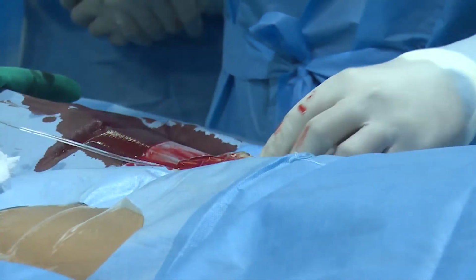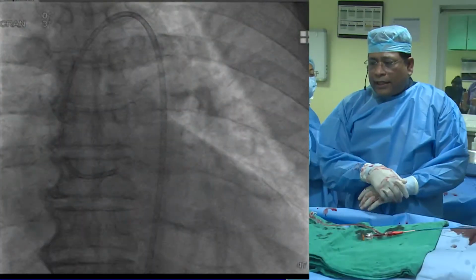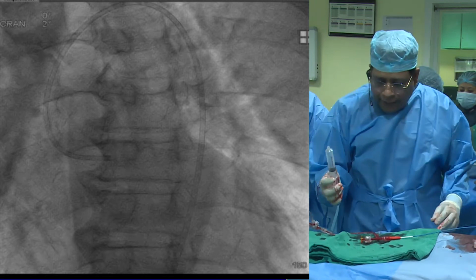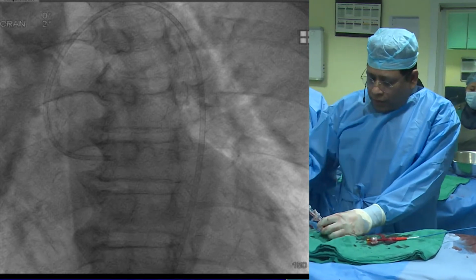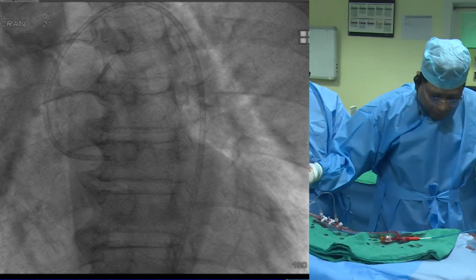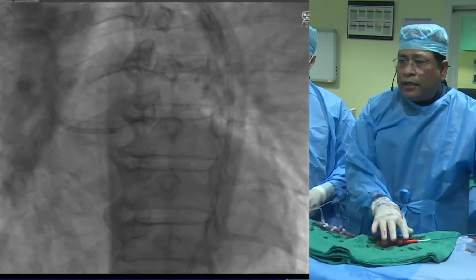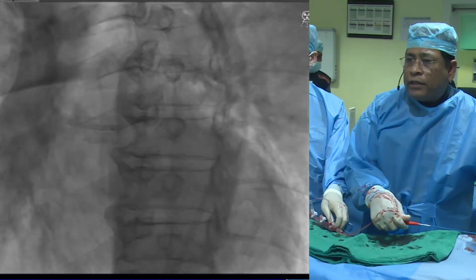Now there should not be any problem. Give me a 7 French guiding catheter, okay? Saturation is 89%, give oxygen. This is a very crucial step, engaging the guide catheter without giving a contrast. So you see, this is a 20 ml normal saline, and the movement of the catheter is very important. If it moves with your coronary, then you can appreciate that it is there, and it can be confirmed with the changes in the T wave. So this is really an important step, okay?